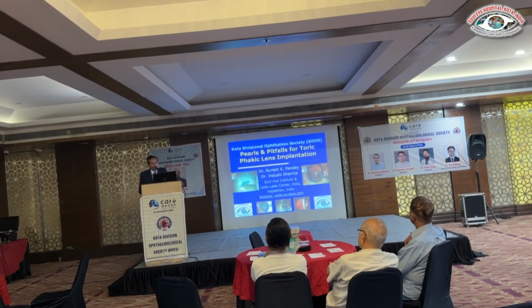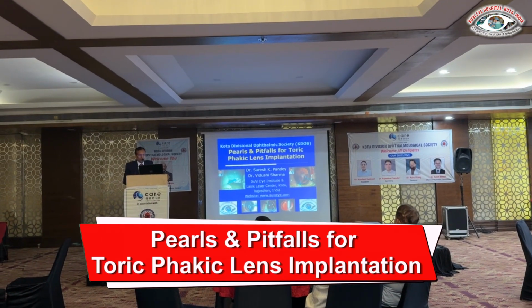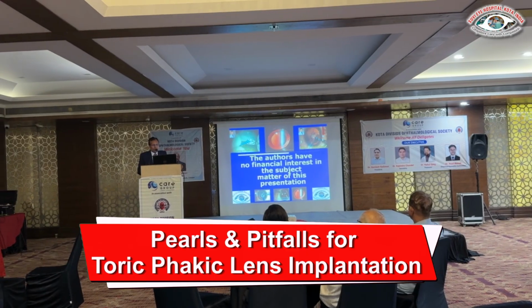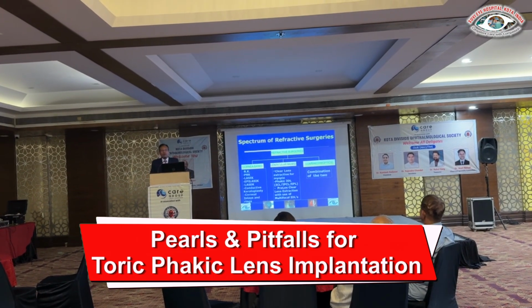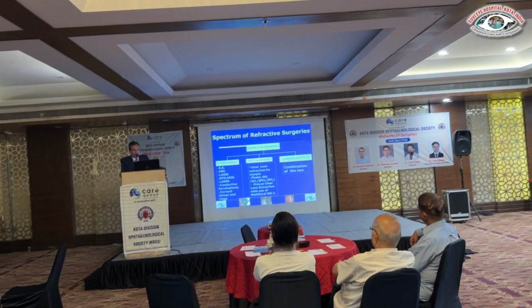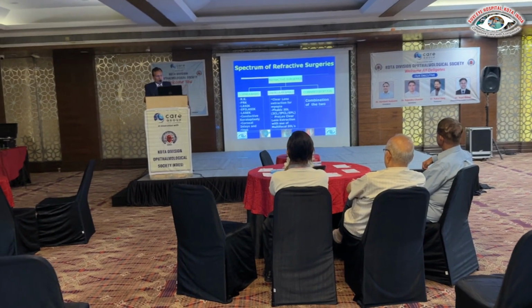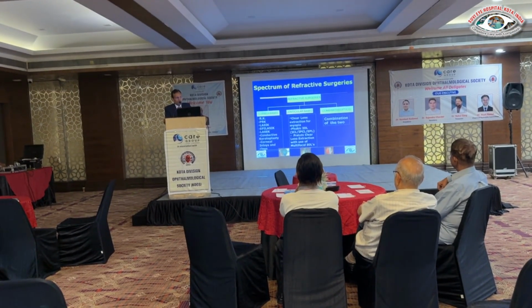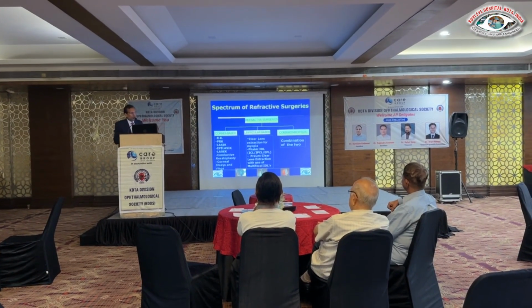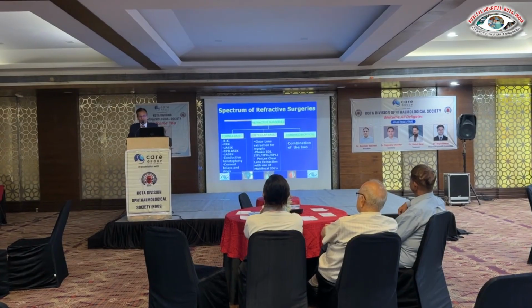So today I am going to talk about the pearls for Toric Phakic lens implantation. As we know, Phakic lens implantation remains an important part of the refractive surgery spectrum. Once we talk about refractive surgery, it can be divided into 3 major groups. Cornea based, which includes the famous RK.